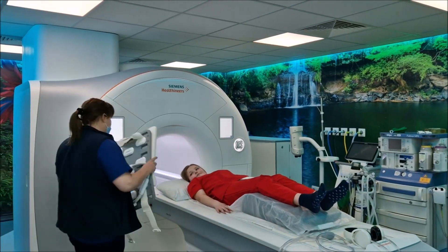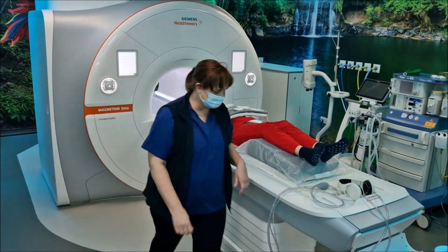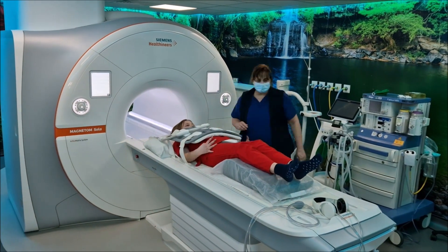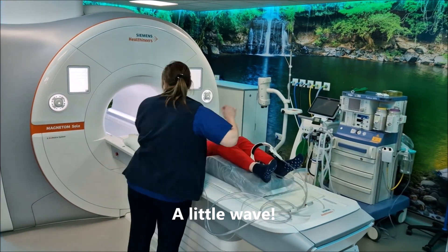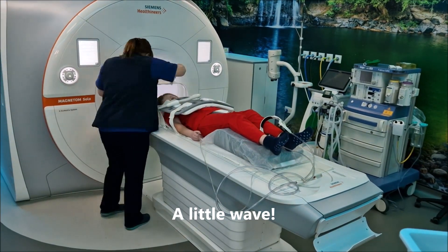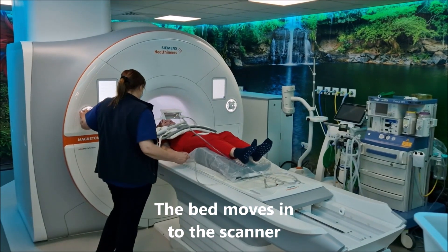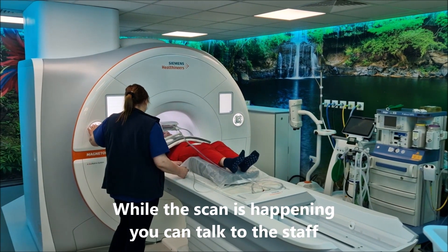After we've done that, we'll put the blanket on, which is the camera so we can take the pictures of your heart. You'll also get a little buzzer in your hand — if you want to talk to us during the scan you can give that a buzz. And then we'll put the headphones on because the MRI scanner can be really noisy, as noisy as somebody drilling up the road next to you. And then we'll put the mirror on so you can actually see the movie.